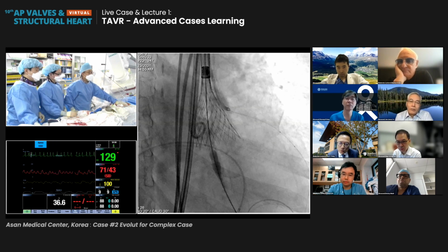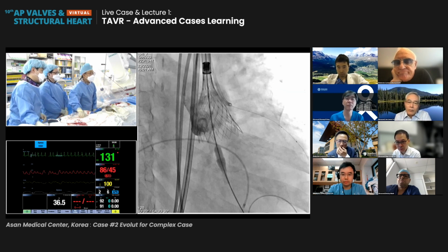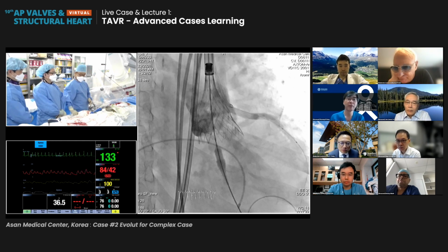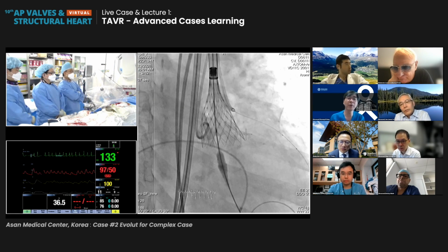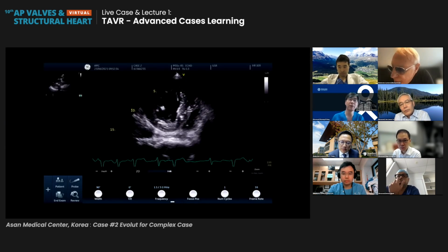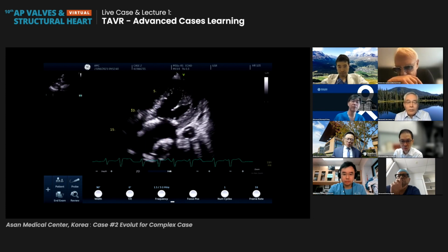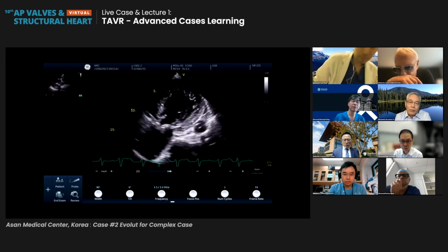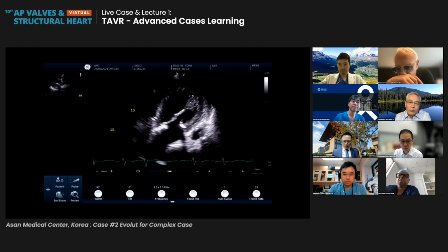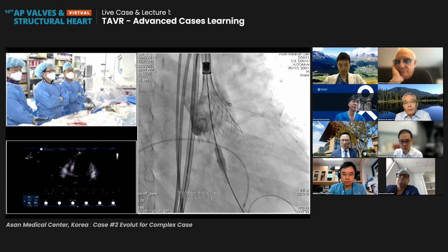자, pigtail 한번 여기서 찍어볼게. 네, 선생님. 자, 풀샷. 한번 에코를 한번 봐주시겠어요? 네. PT를. Considering the hemodynamic status, I think this position is reasonable. Yeah, I think so. Okay, the special echocardiographer and check it up. There's no regional wall motion abnormality. Okay, but the contractility is not so good. But I think the baseline is the same contractility. Could you check it up? How much PVR? Okay.